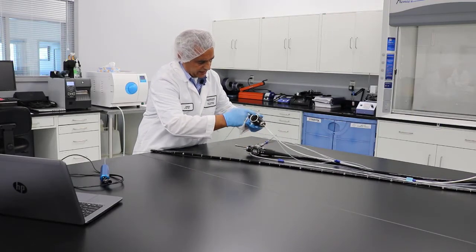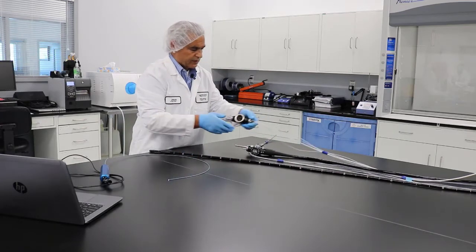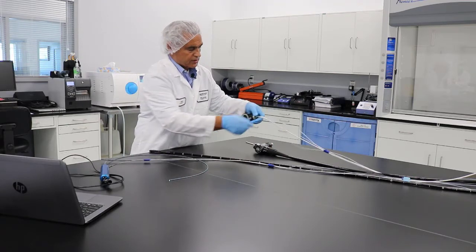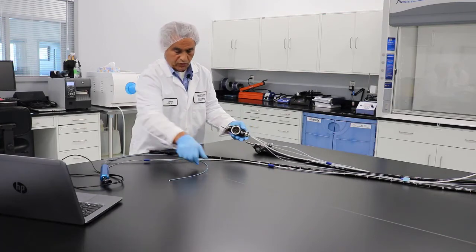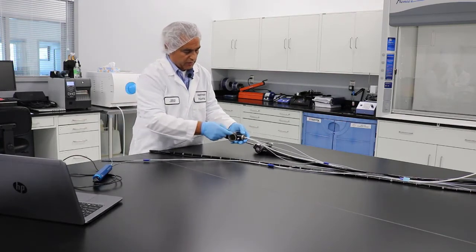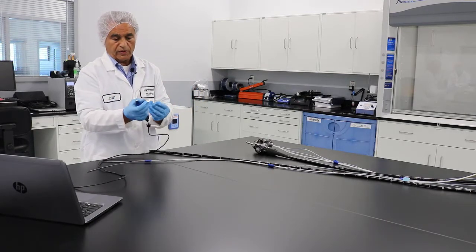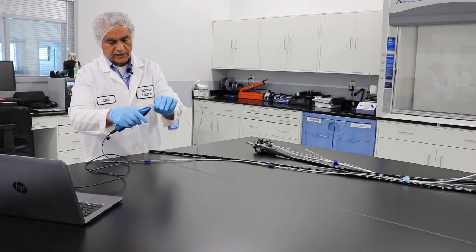There are a lot of 90-degree angles that the scope has to go through in these parts, so you don't want to push it into any of the other channels. As you can see, you have the biopsy suction port — the large one — but you also have the air ports, the water port, and the auxiliary water port. Those are really small; you cannot really use this scope to go in. This scope is about 1.9 millimeters in diameter, but those ports need a scope of about 1 millimeter or even smaller.